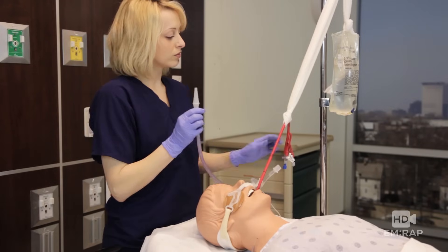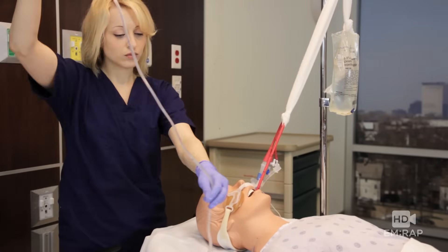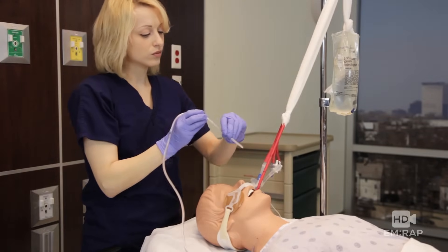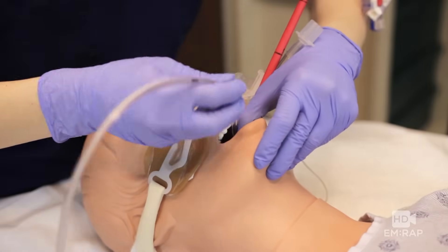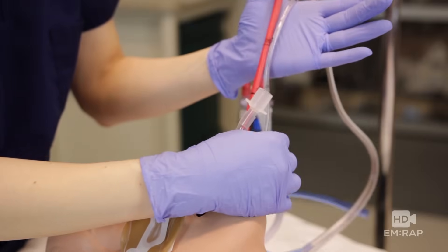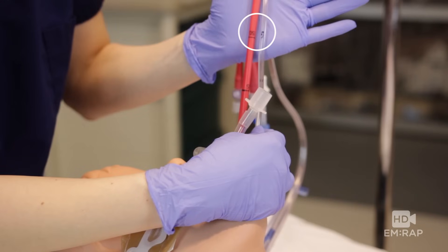Now connect suction to the gastric port and suction out all of the contents of the stomach. Insert the OG tube so that the G we marked lines up with the 50-centimeter mark on the Blakemore — now we know the tip of the OG is just above the stomach balloon.